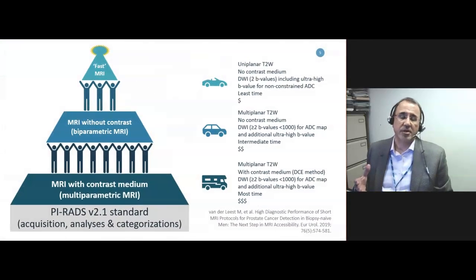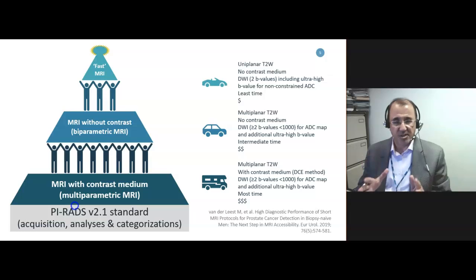When we talk about biparametric MRI, or MRI without contrast, we really have to compare it with multiparametric MRI, that's done according to the PIRADS standard.